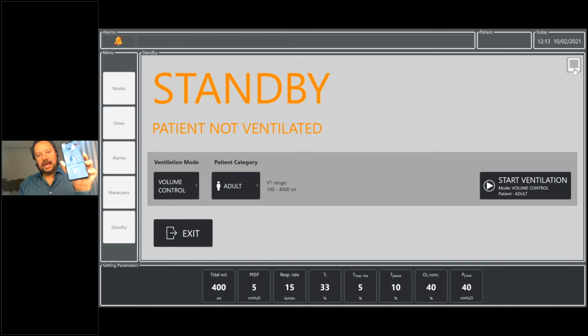Okay, so you will have on your screen the mobile screen. So you will have the controller that will enable you to change the vital signs and the lung parameters, and then of course trigger some changes in the situation of the patient. Okay, so this is on the mobile phone. So I will quit from the mobile phone because I cannot share two screens. So I will show you exactly. So it could be on your mobile phone.